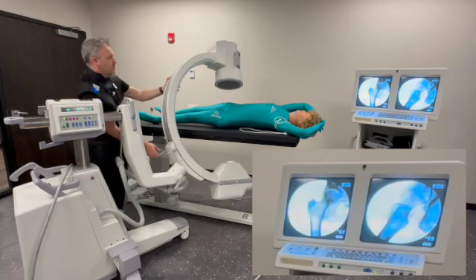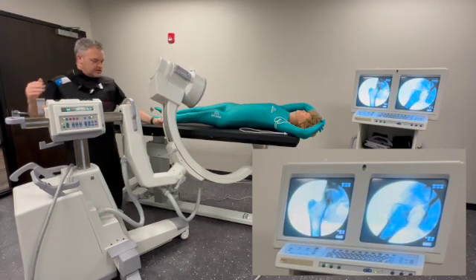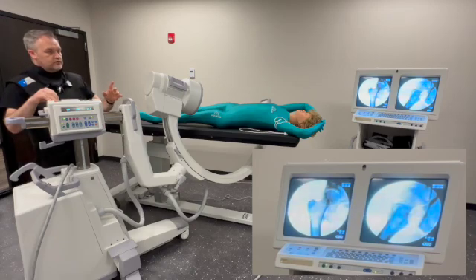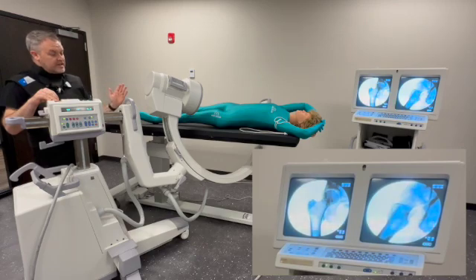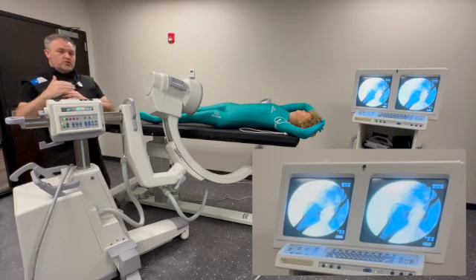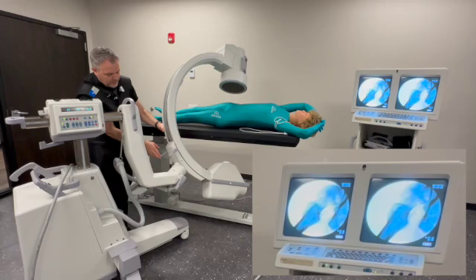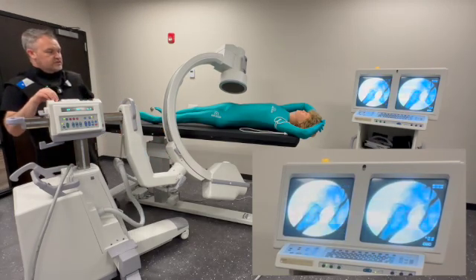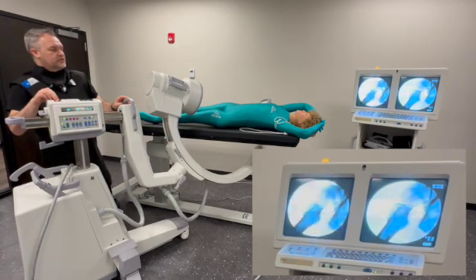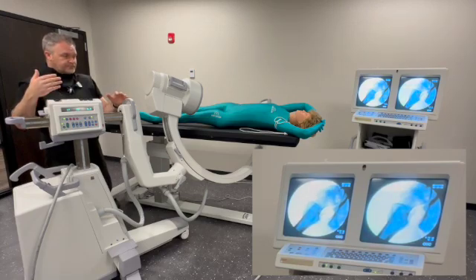Now if I come back through for my lateral, taking care not to hit the bed — I have this unlocked but I should be clear because I already cleared that path. I'll lock in. I still have my previous lateral on the right screen, so let's see if I can keep these angles on the C-arm. We actually have the same alignment. I'm now in a position where I can go back and forth — there's my lateral, and we come back up to the AP. I can move faster now because I've made that path. As long as someone is paying attention to the drape, I can go back and forth between my lateral and my AP as the surgeon gets the start position, advances the drill, and advances the actual nail.